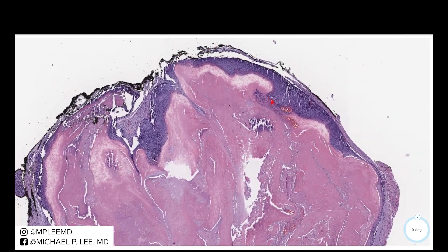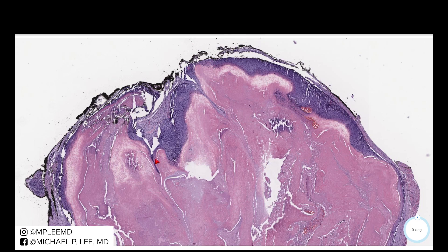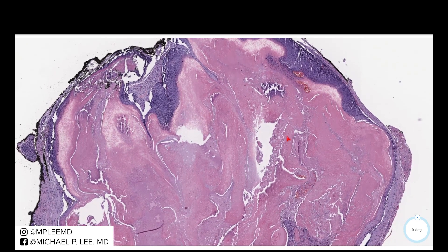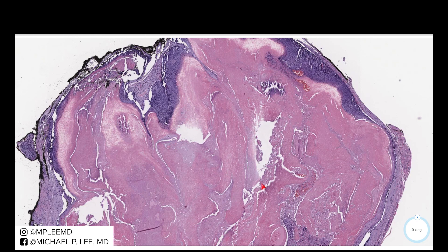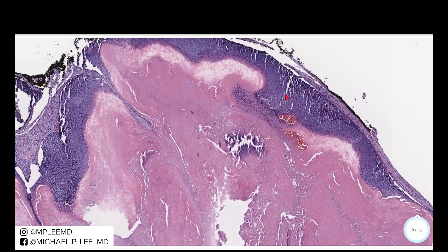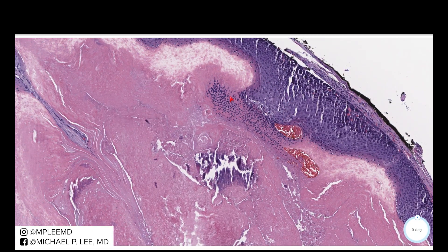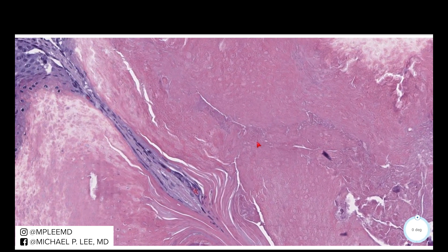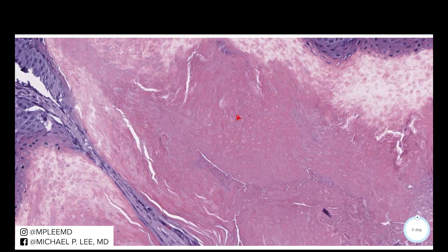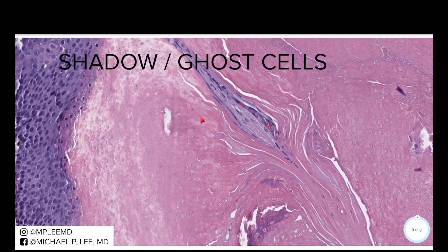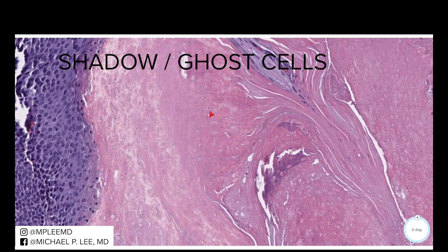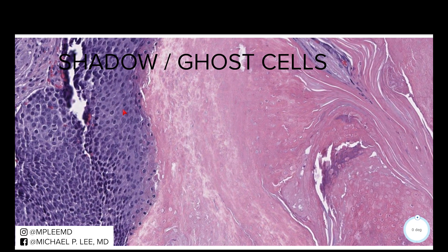Along the outside edge, we have this basaloid rim — these blue cells — and then towards the center, we have this pilomatrical keratinization. As these cells proliferate and become keratinized, they lose their nuclei, leaving these characteristic pale remnants — the shadow of old cells. These cells are called shadow or ghost cells. They're the remnants of the basaloid cells of the hair matrix after undergoing keratinization, leaving just this little remnant or shadow of a cell.